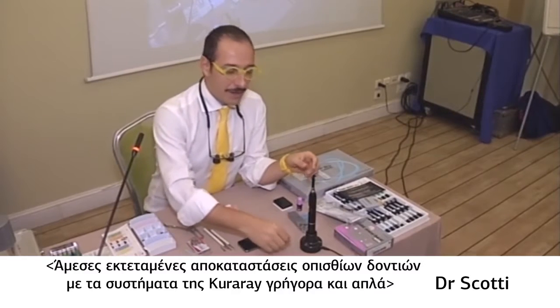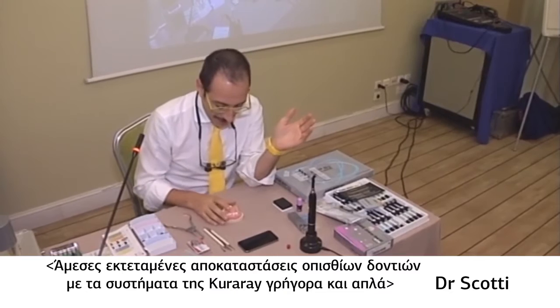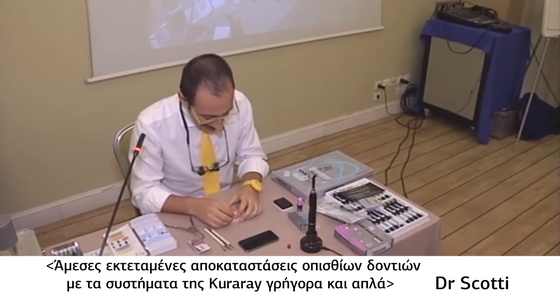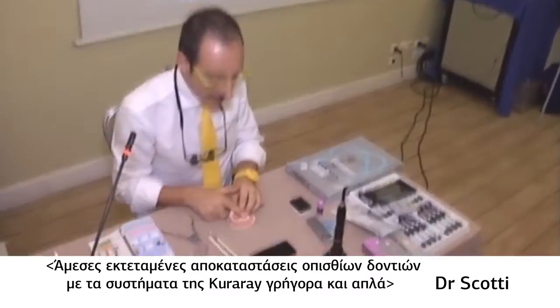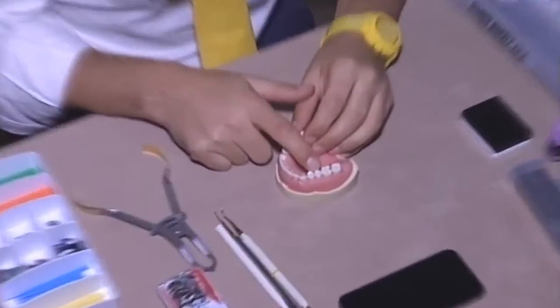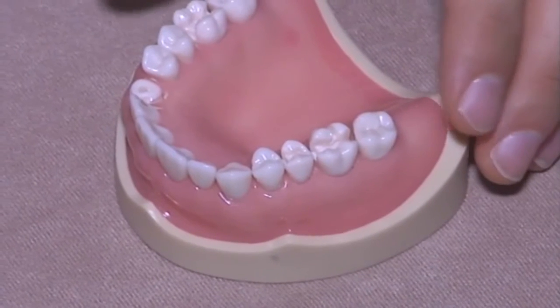Third part, today we are going to cover almost everything of direct restorations. We're going to perform two direct restorations on two posterior teeth. Here we have a model with MOD cavity on a first molar and occlusomesial cavity on a second premolar.